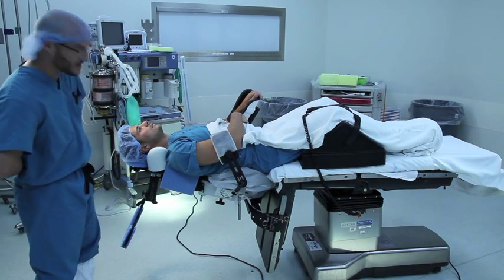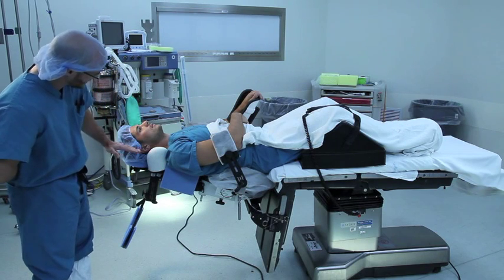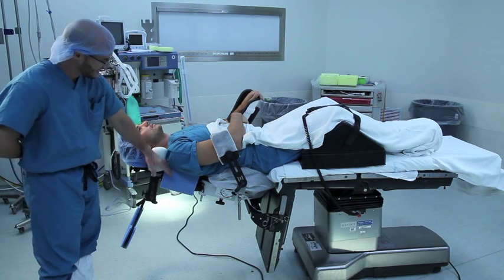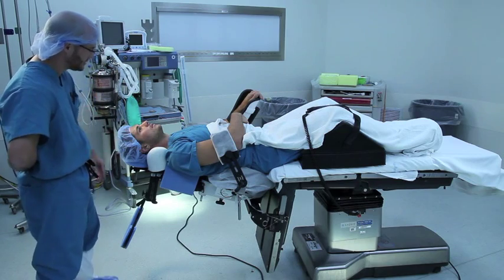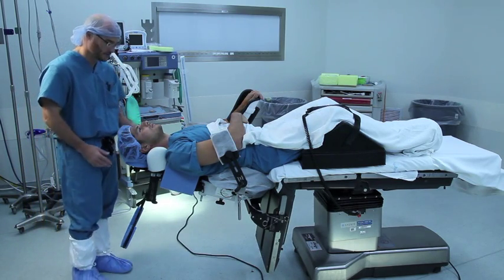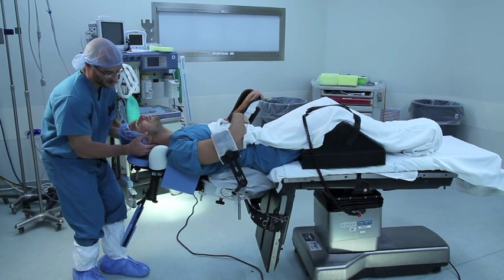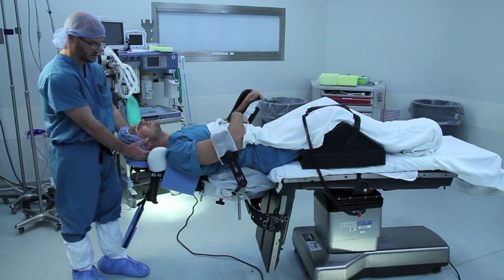When the patient is in the intubation position, we check the alignment of the thorax relative to the head. The thoracic pad is supporting the patient's thorax. Another maneuver that the anesthesia team will want to be able to do is to rotate the head and displace it anteriorly to achieve the sniffing position.